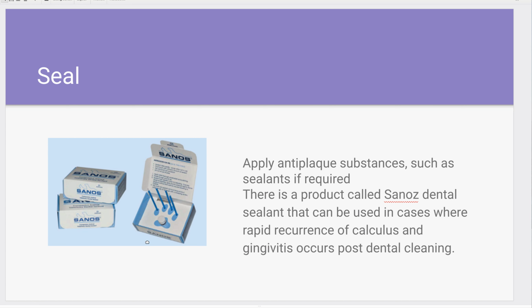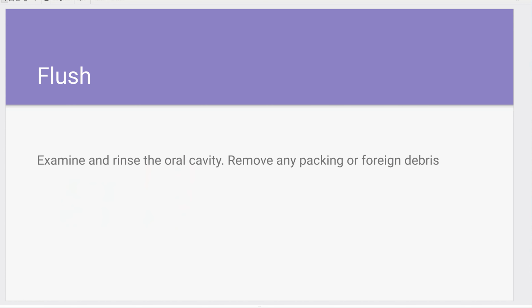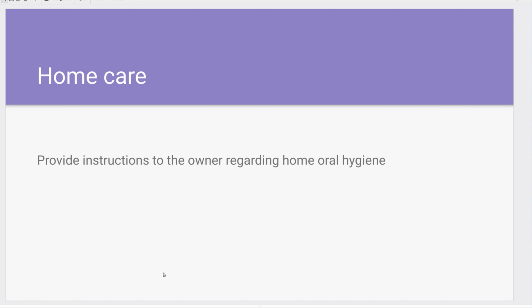Then we flush the oral cavity, we remove any packing material, which is obvious, and make sure that there's no foreign debris or blood or anything in the mouth, because waking up with a mouthful of blood is really revolting, speaking from first-hand experience. So the last thing that we need to do is to provide home care.